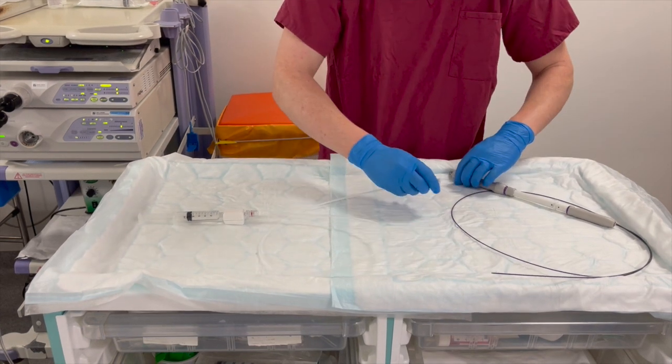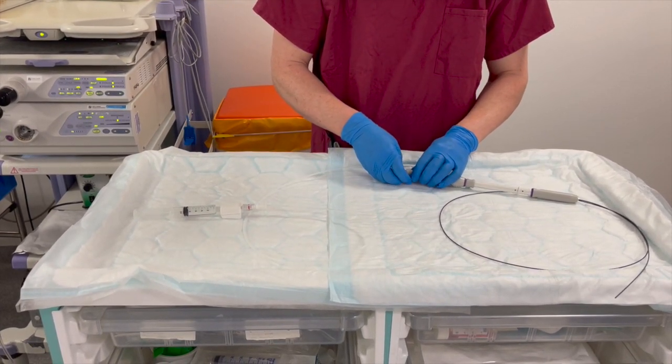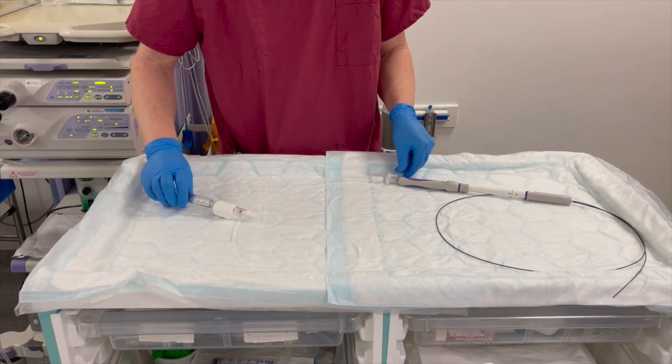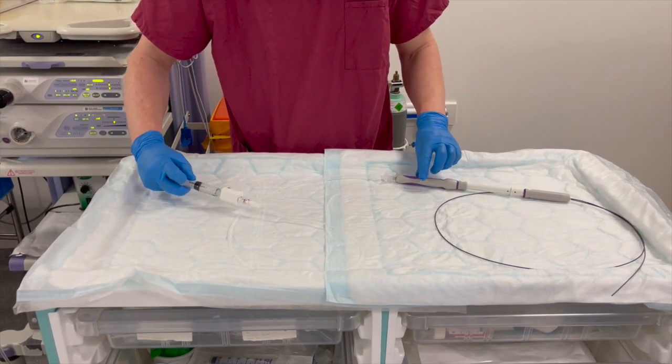Those of you familiar with a 25 gauge will know it does take a little pressure to flush the needle and only a few mils are required. It is really important to make sure there is no air in the system, and of course, once fully flushed, do not remove the saline syringe.